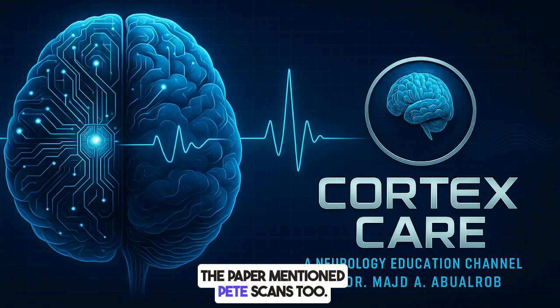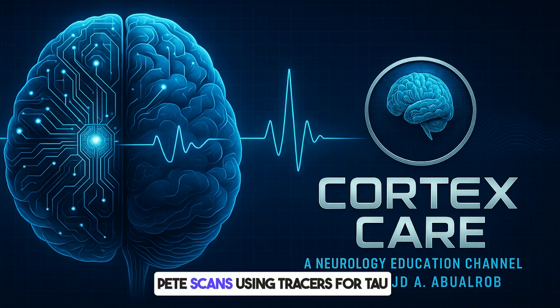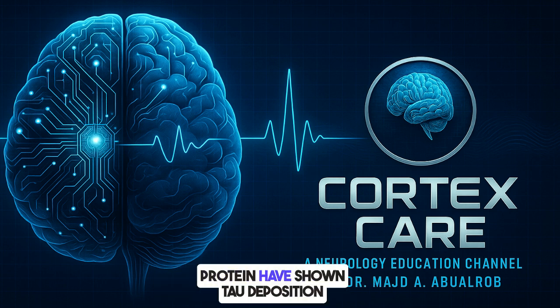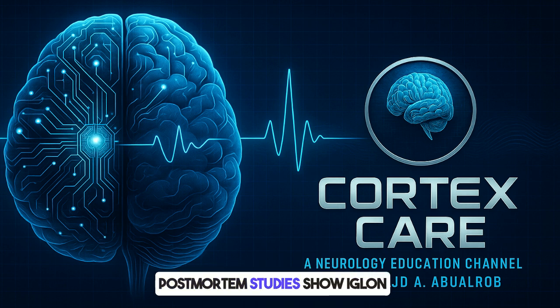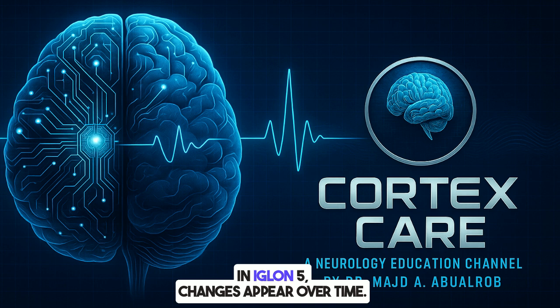The paper mentioned PET scans, too. Right. PET scans using tracers for tau protein have shown tau deposition in the brainstem and cerebellum. And that matches the pathology. Exactly. Postmortem studies show IgLON5 is a tauopathy, so the PET findings fit with that. What about follow-up MRI in IgLON5? Changes appear over time.